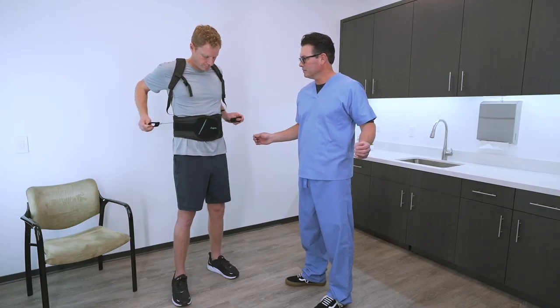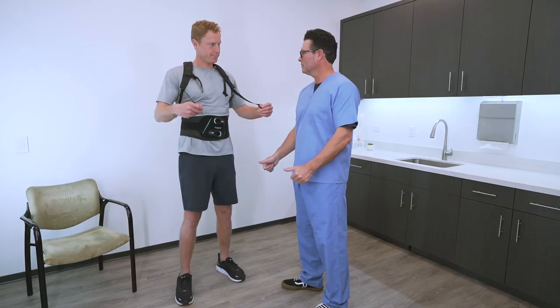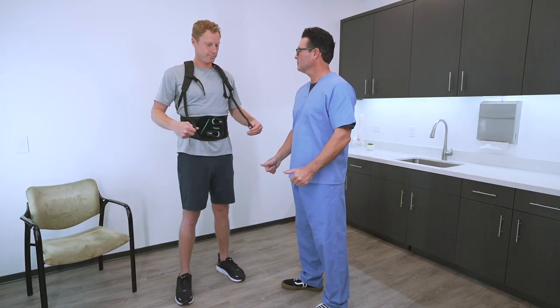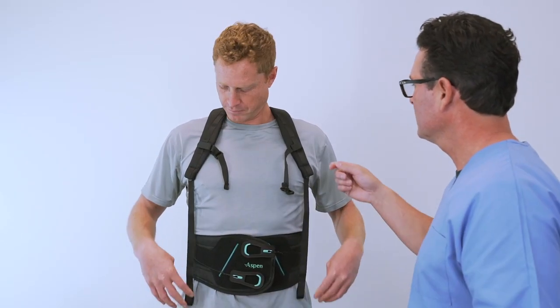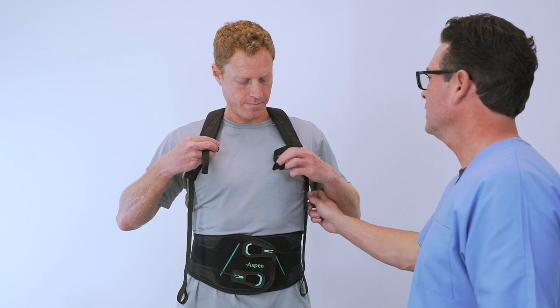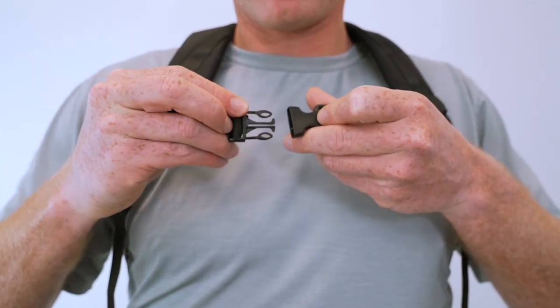Next, readjust and tighten the belt as shown previously. Using the thumb loops, tighten the shoulder straps to achieve a snug but tolerable fit. If desired, connect and tighten the chest strap just enough to pull the shoulder straps away from the underarms.